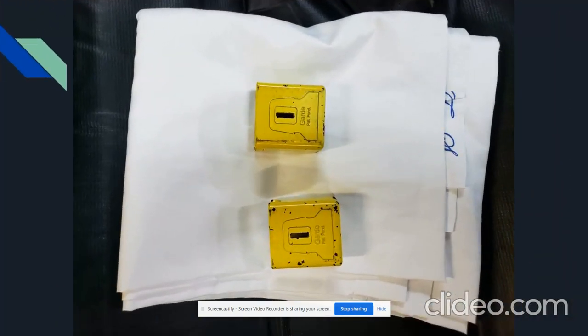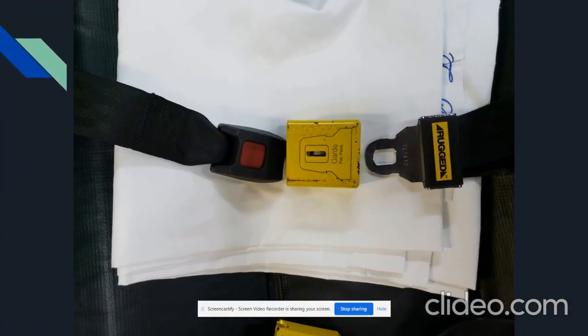Here is an example of the buckle guards. On the ambulances that I work for, we have 2 buckle guards per ambulance. And the placement can vary to where you deem fit that these go. And this is how the buckle guard is used. You place one end inside the metal piece and the other end clicks into it just like you would normally click into a seatbelt. And then it's locked in.